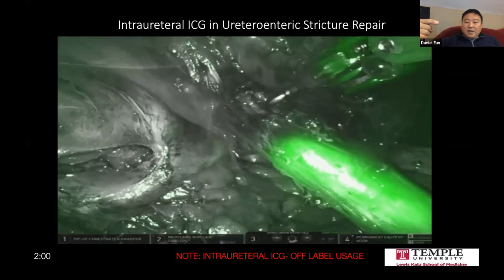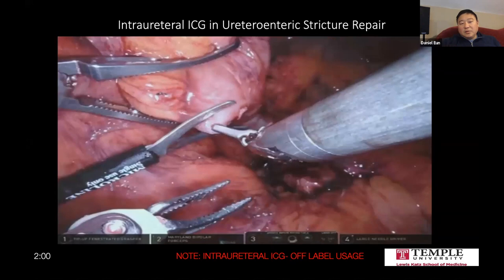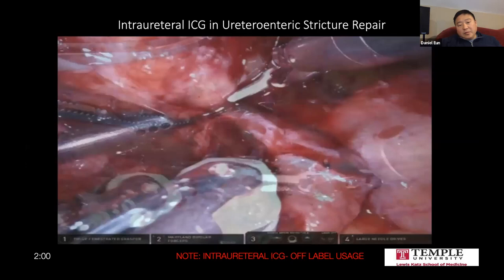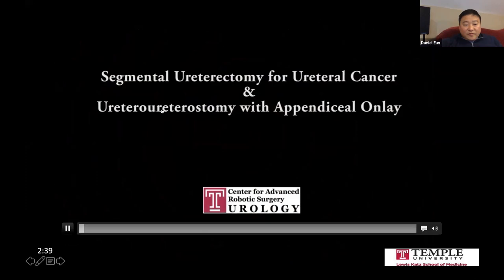And so here, maybe IR was very aggressive in trying to balloon dilate this, but it was completely avulsed off the base of the conduit. So here we're going to spatulate it. And here the hard work is all done now. The rest of this is almost like a glorified pyeloplasty. The skill set here is very easy to put it back together again. It's really the fight to get here and to understand the anatomy and to dig everything out and have it ready for you. And so a few more video examples of how this can look intraoperatively.